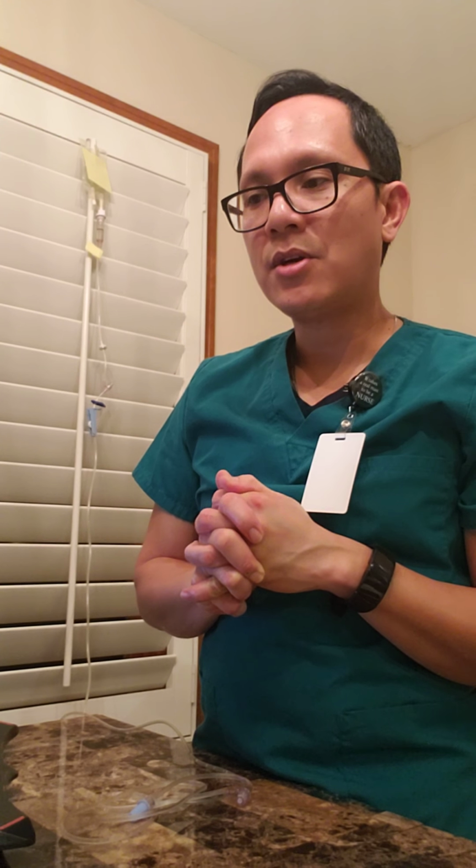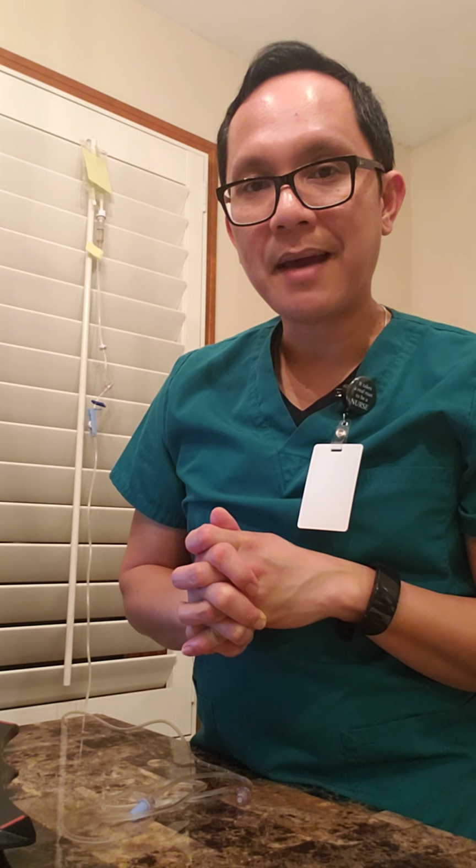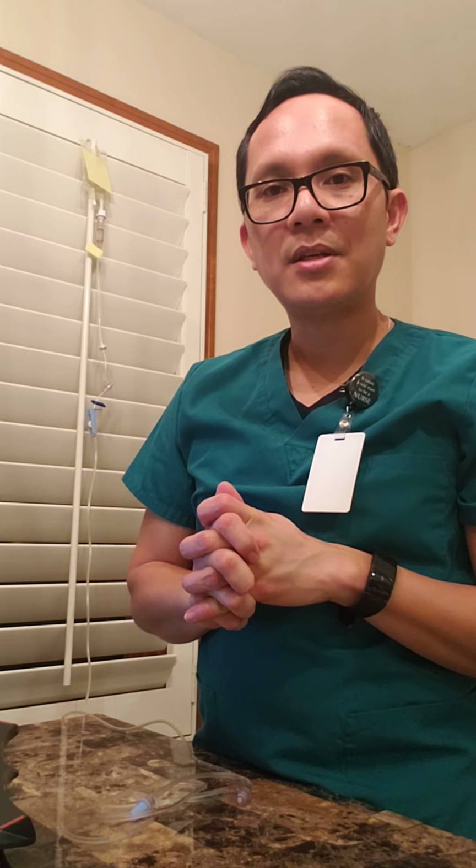Just ask my patient if she needs anything, and if there's none, thank the patient for letting you do her medication administration today, and make sure you come back and check the patient after like 30 minutes or an hour or after the medication is done.